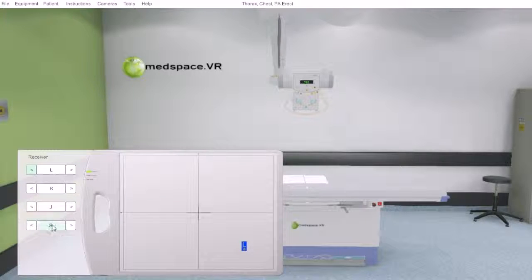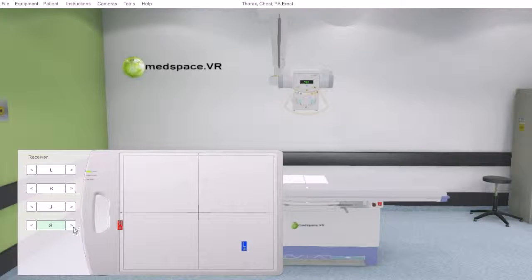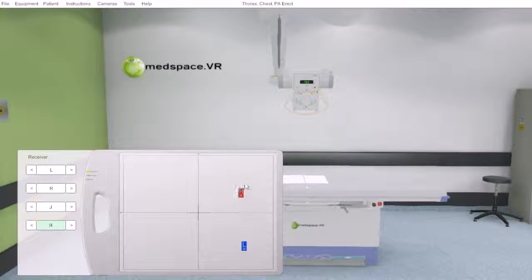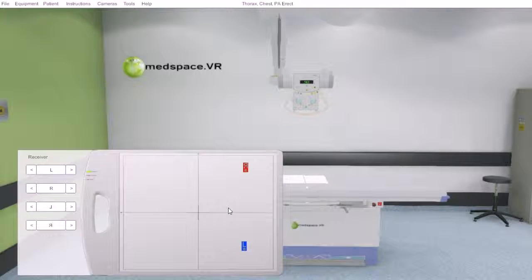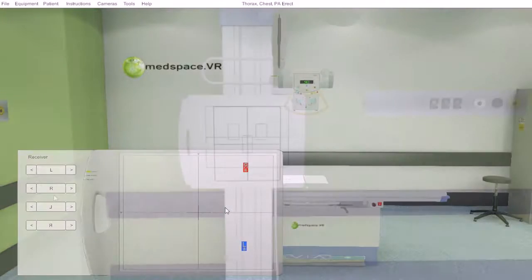We also have our PA markers, should we wish to place them depending on the projection we are doing.